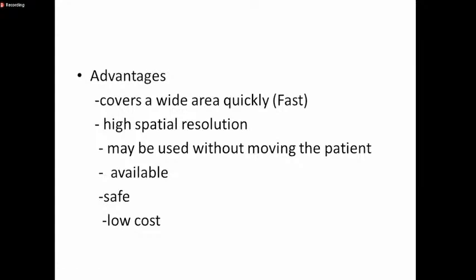And this is a modality that is quite available. Almost every hospital has got an X-ray machine. Wherever you're going to work, you'll find it. Safe here is relative because we are using radiation. You need to be careful about radiation.